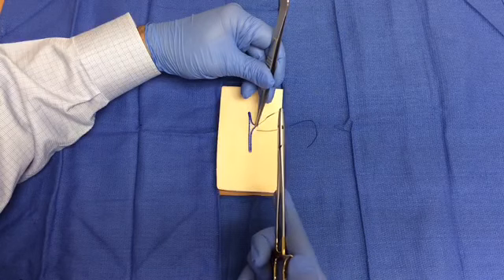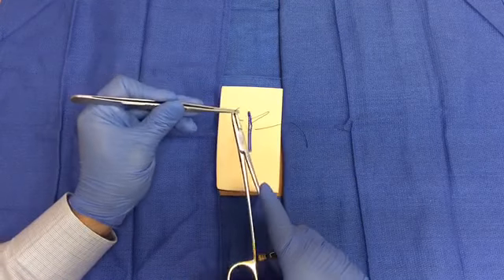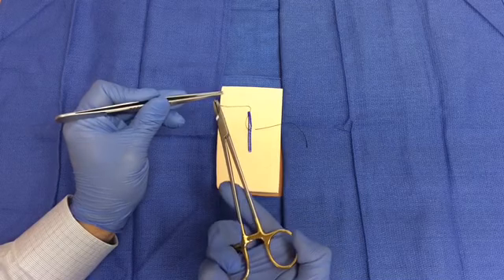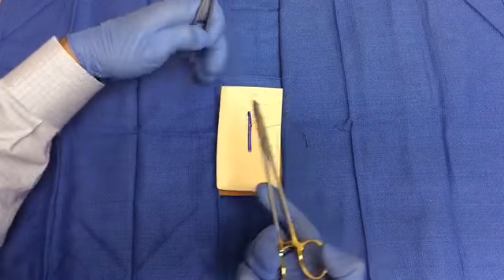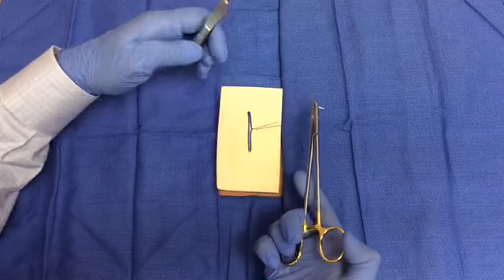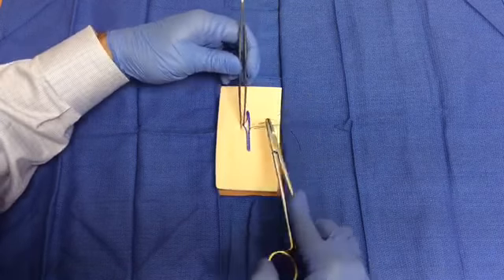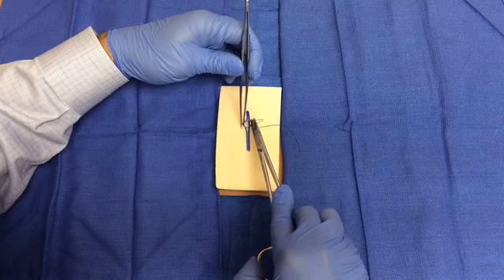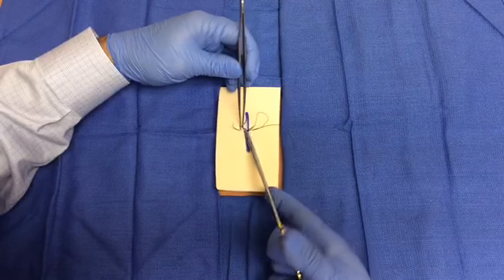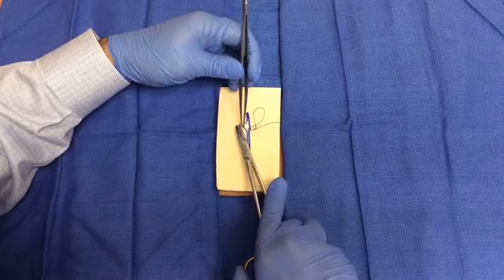To adjust the needle position in the needle driver, grasp the needle with your forceps and load it appropriately. The needle should be at the tip and perpendicular to the instrument, loaded at its midpoint to two-thirds back. You may approximate the line of your next bite by making a mental note of where the suture material comes straight across the wound. Now grasp the tissue on the opposite side and evert the skin edge. Enter the tissue inside the wound with your wrist prone, carefully supinating to follow the curvature of the needle as it exits the tissue. Release the needle, pronate to pick up and supinate, continuing to follow the curvature of the needle.